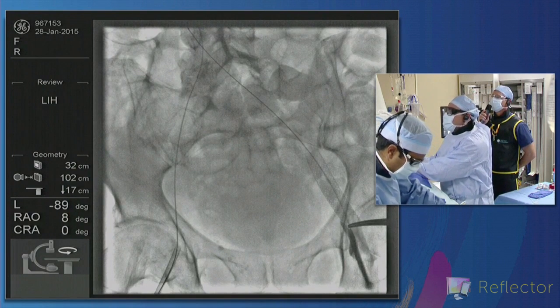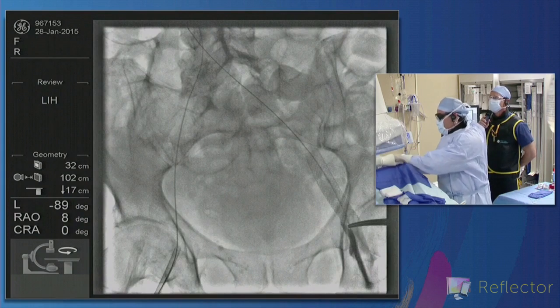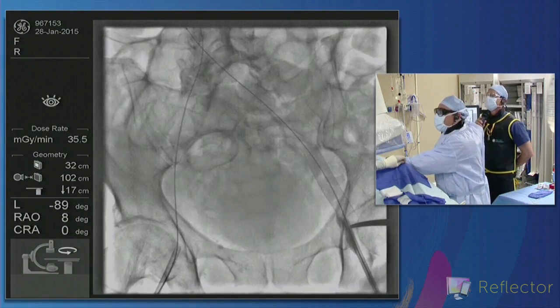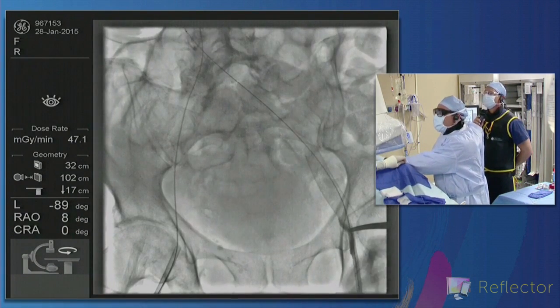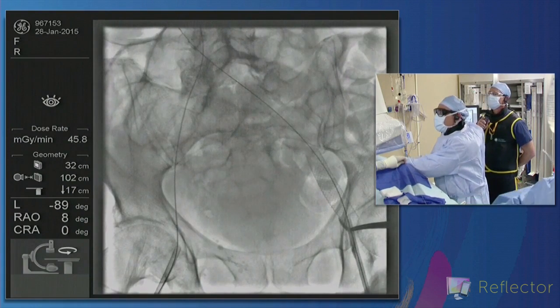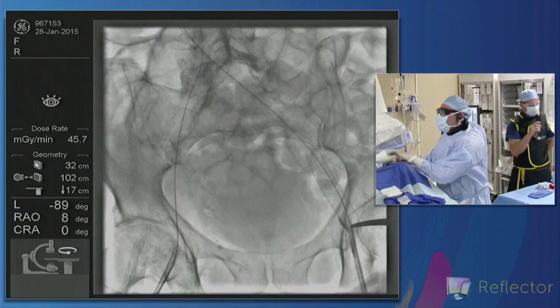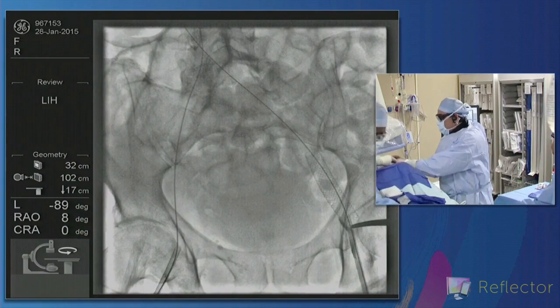So I've got to give Dr. Herman credit for trying to do this from this side. I think I would have come up and over too. So yeah, he's close there to the puncture. He's going to pull this back and get the sheath back in, and it looks like it's fully expanded so that we didn't get caught up in the venotomy. That's right.